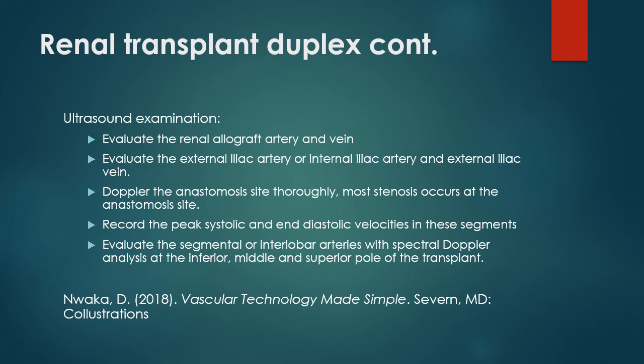Ultrasound examination of a renal transplant: evaluate the renal allograft artery and vein, the external or internal iliac artery and external iliac vein, and doppler the anastomosis site thoroughly, as most stenosis occurs at the site of anastomosis. Record peak systolic and end diastolic velocities. Evaluate the segmental or interlobar arteries with spectral doppler at the inferior, middle, and superior pole of the transplant.